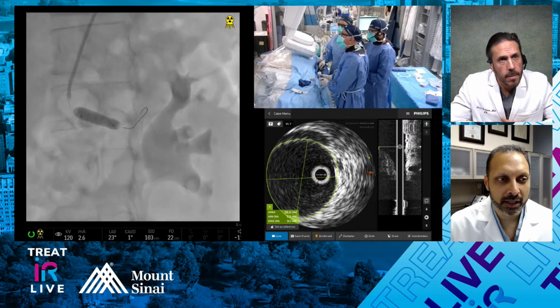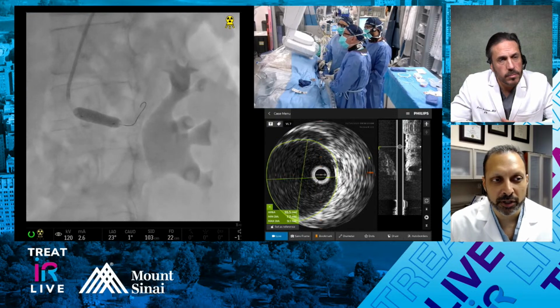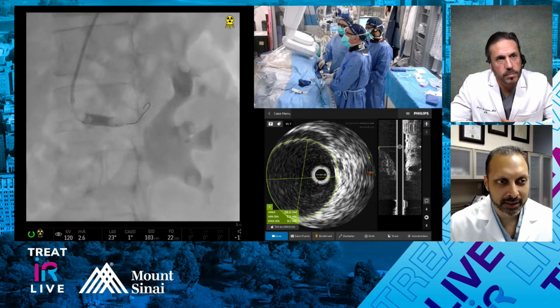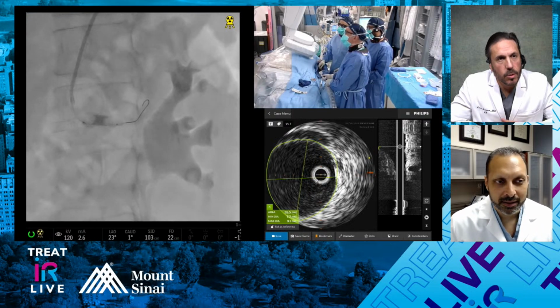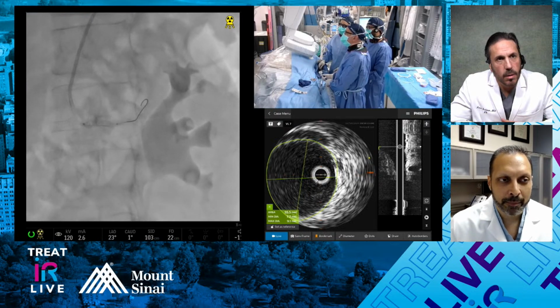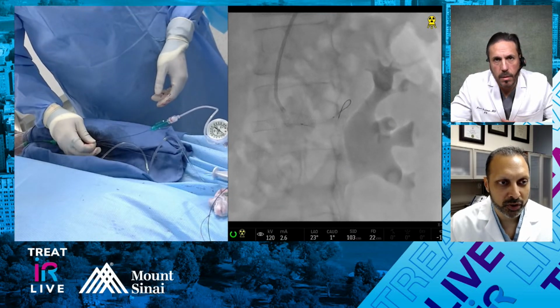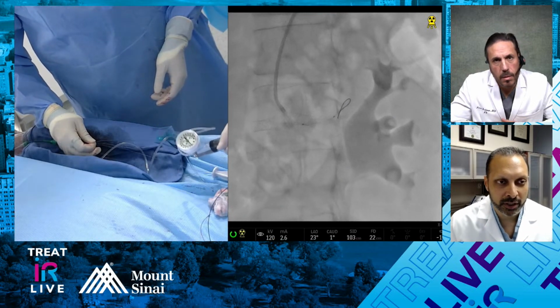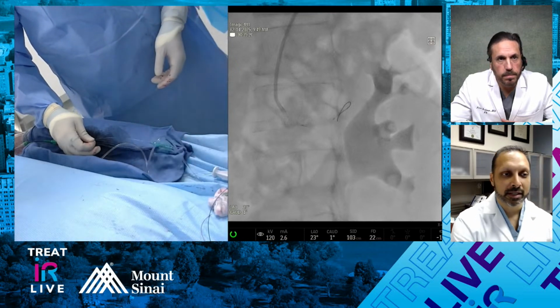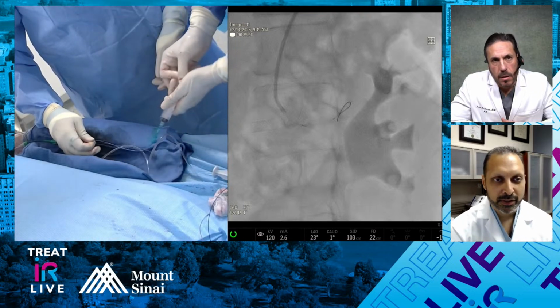The comment being, obviously, if you have your sheath buttressed up against the stent too much, the little bit of the shoulder of the balloon could push your stent forward or back. Right. So it's more of a technical thing, not because of the design of the stent per se. That's just something to keep in mind. You might bring the sheath back a centimeter clear of the trailing end of the balloon, so that when the balloon inflates, you're not inadvertently stabilizing the sheath and pushing your stent forward. But I think you did a nice job there. Just take a look and see how it's looking.